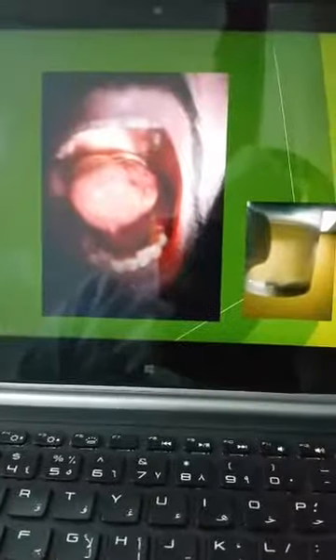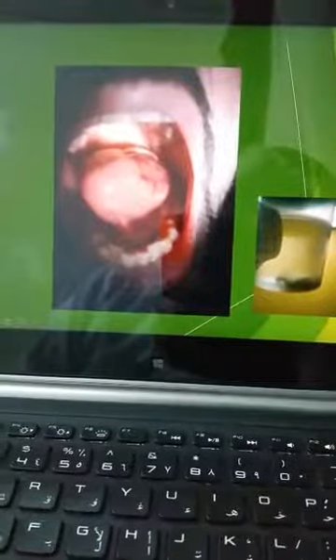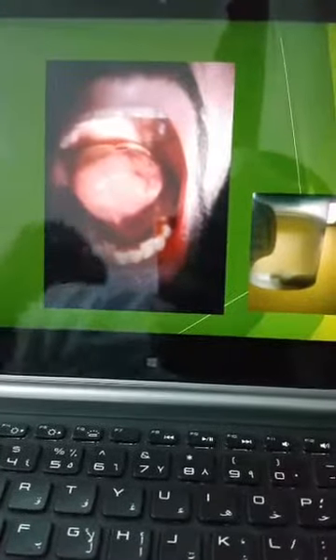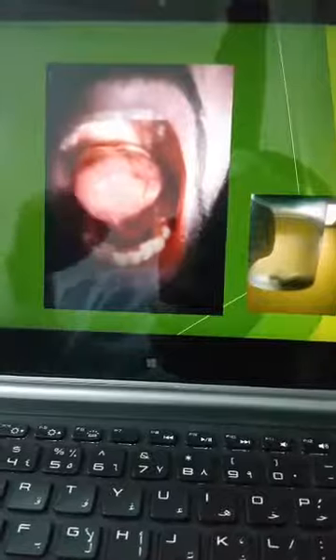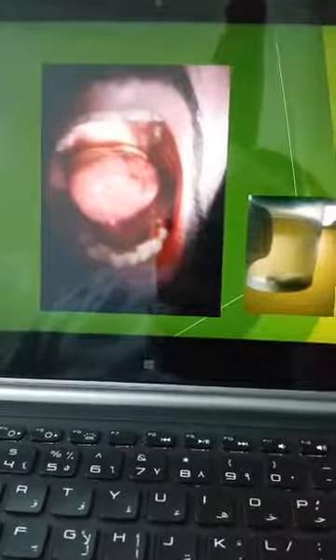A lesion like this, if you are going to remove it, you can do this under local anesthesia. I did this under local anesthesia with CO2 laser, and I removed it. I put it in pathology formalin, and there are no sutures, as you could see. So there is no tethering. The patient can speak fluently without any effect on the tongue movement. And the only tool, or the best tool, that can do this is the laser.